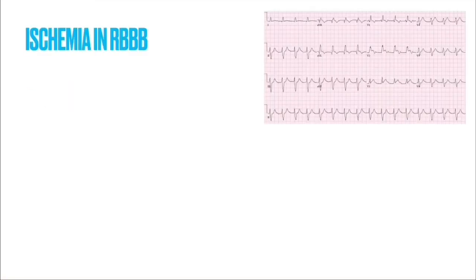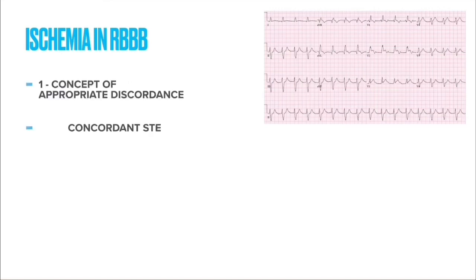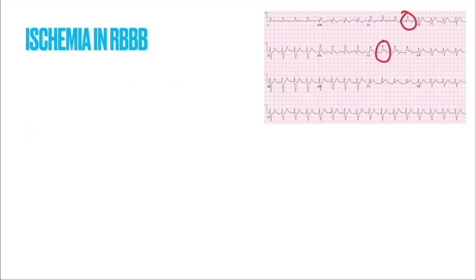How do we identify ischemia in right bundle branch block? The first concept is appropriate discordance. We already discussed that in right bundle branch block, the terminal QRS deflection and STT changes are in discordance. If there is any concordant ST elevation, this indicates ischemia. Here we can see in the ECG there is ST elevation in leads V1 and V2 — that is a concordant finding that we will not see in normal RBBB.